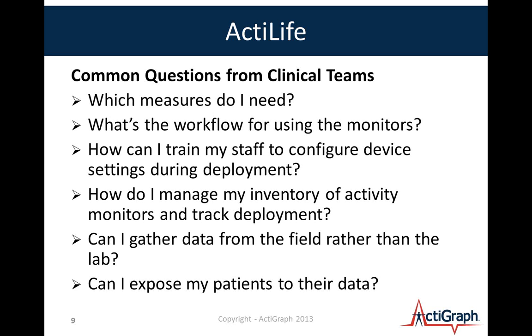Historically, we've provided some leasing options, and we've helped track inventory and have helped them maintain, what's the latest device? Do I have the latest? So what's the method for doing that? What's the best way for me? Other questions we've heard is, can I gather data from the field rather than in the lab? Can I start to get data from my patient while they're wearing it? And can I expose this data to my patients? I might want to show my patient their improvement. I might want to encourage them. Some protocols discourage that, but some ask for that. And so that has been a question that has come up.